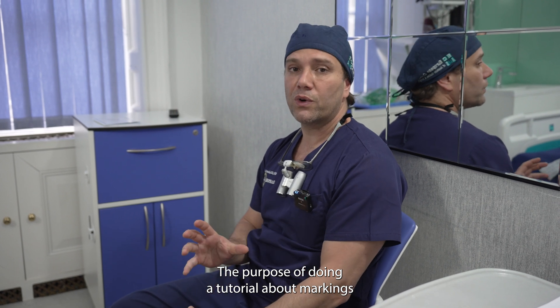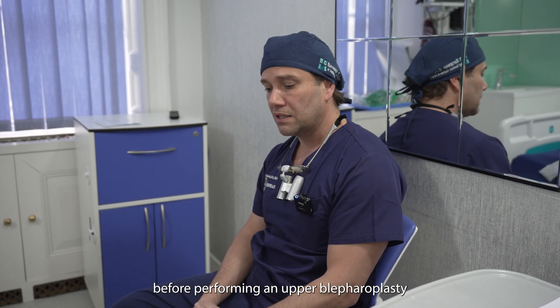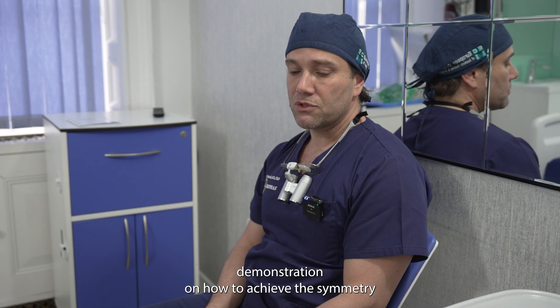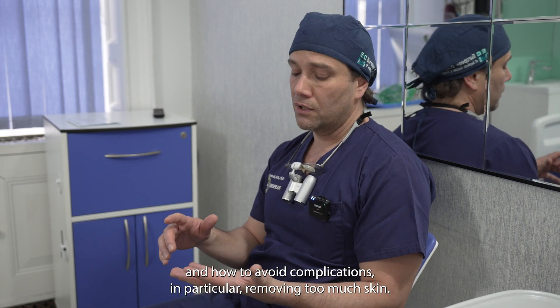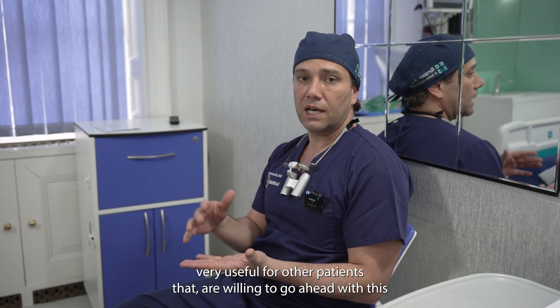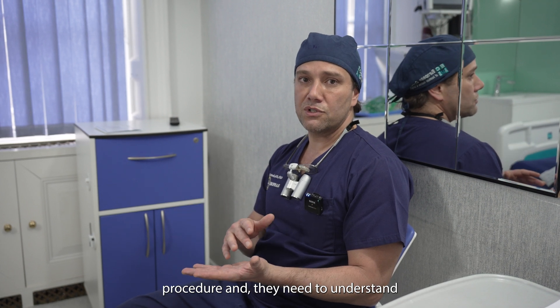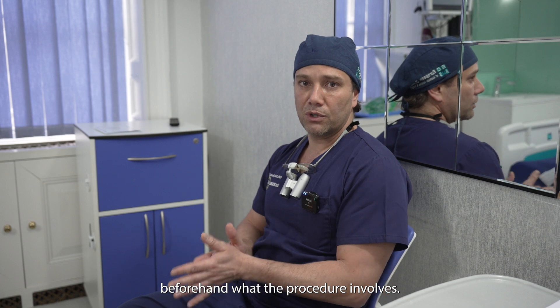The purpose of doing a tutorial about markings before performing an upper blepharoplasty on one side is to have a demonstration on how to achieve symmetry and how to avoid complications, in particular removing too much skin. I also think it's very useful for patients who are willing to go ahead with this procedure and need to understand beforehand what the procedure involves.